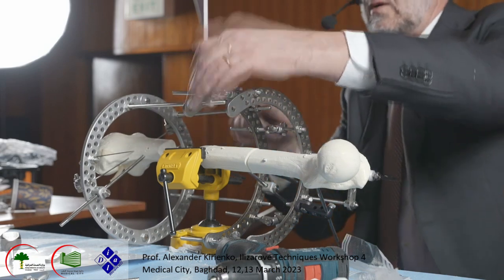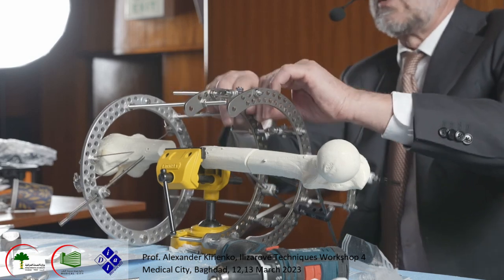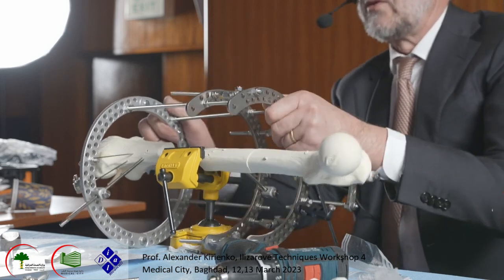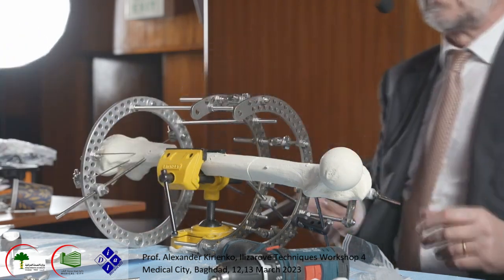Obviously, when you arrive in contact, we should control if there is displacement or not, and you may do it in the operation room if you prefer to do revision of the docking site, or you may do a translational system and realign it with this system.